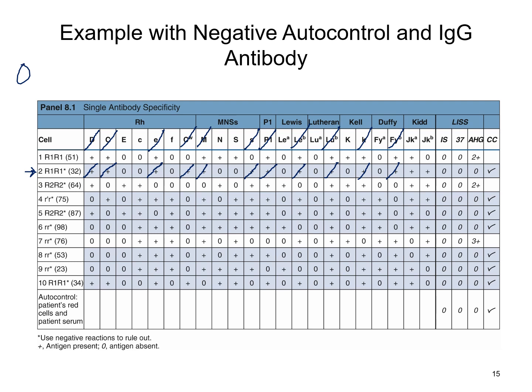All right, now we're going to our next negative reactivity, which is going to be number 4. And we've already ruled out those first couple, so we can kind of skip them. Next, we're looking at E, not present. Little c antigen is present, but it is a heterozygous cell, so we cannot rule out based on that. F. All right, going on across. S, it is heterozygous, big S, little s.